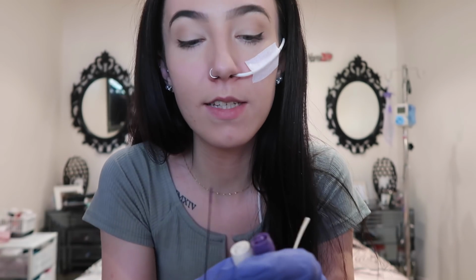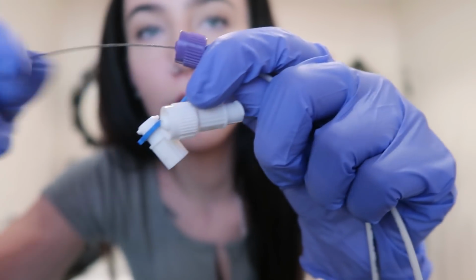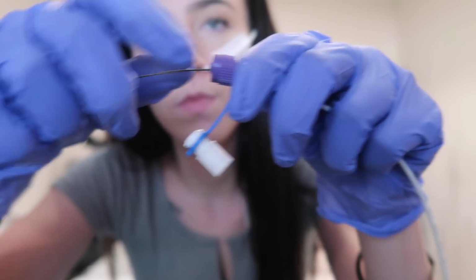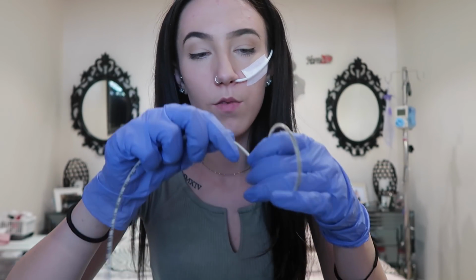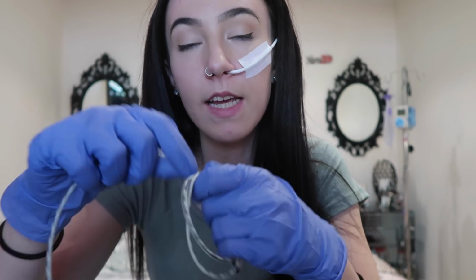So you take the tip of the guide wire, which has also been re-sterilized and put back in the bag because I just want to be extra careful, and I'm just going to thread it back through the tube. Then it's going to stiffen the tube. And we're just going to tighten it like that. Now the tube is pretty much ready to go back in this container. I could reuse the bag, but I think we're just going to coil it up and put it in the little container. So I'm going to wrap it up, not too tight because it does have a kink memory, but just tight enough that it's going to fit in the container.